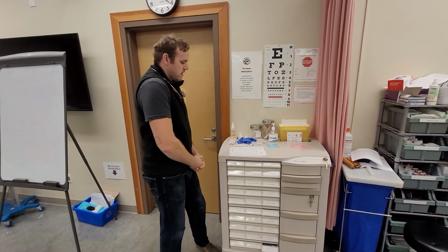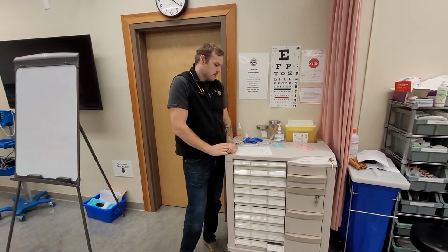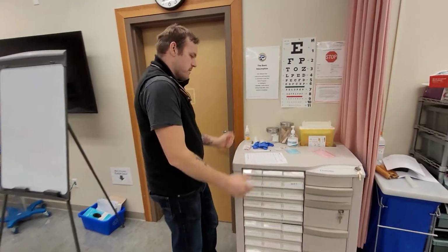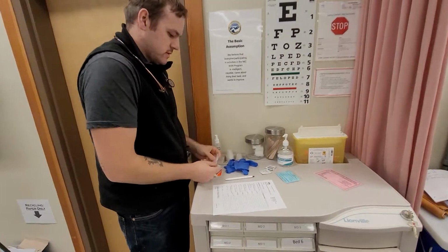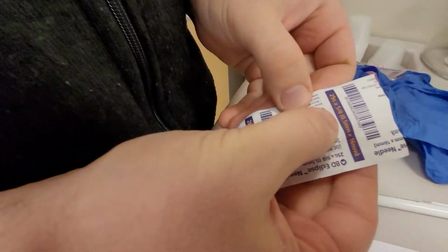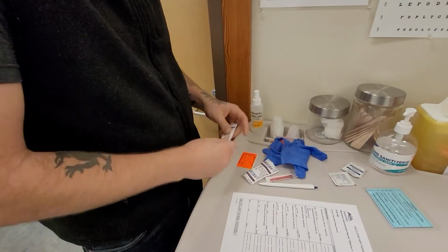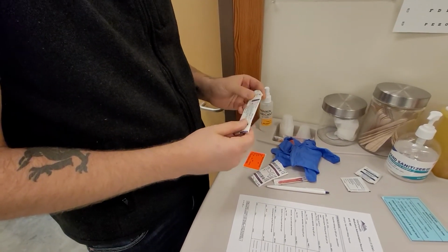Hello, we're going to be giving a subcutaneous medication today, morphine. First things first, I'm going to gather the supplies I'm going to need. We've got a sub-Q needle here, 25 gauge, 5/8. I've got a blunt filter needle, and I've got a 1 cc syringe.